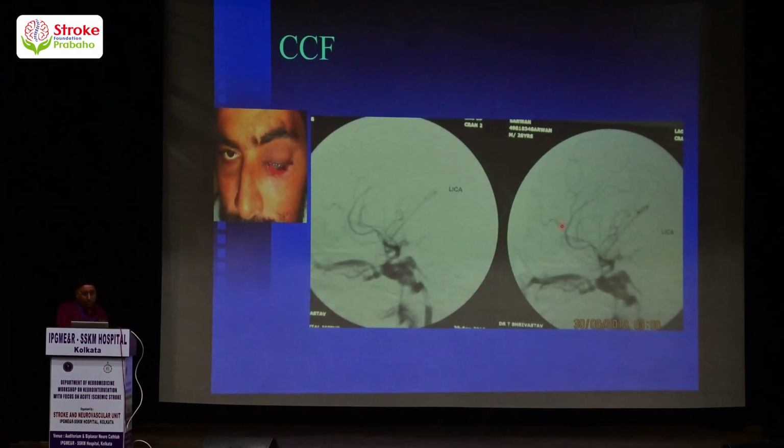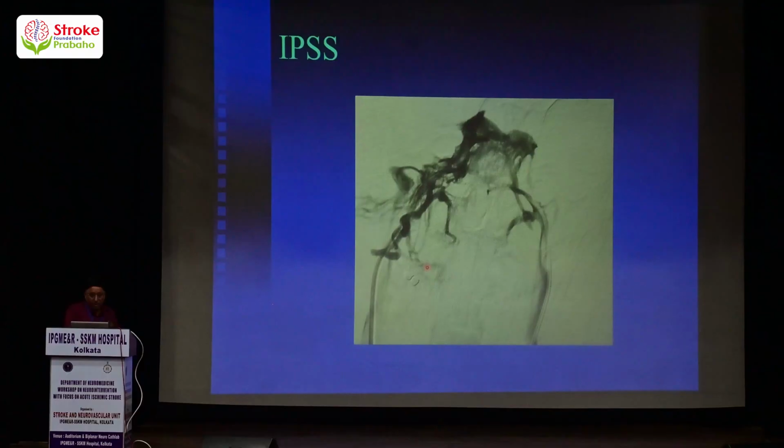Carotid cavernous fistula, again, the gold standard to diagnose as well as treat is the cerebral DSA, and you can see here the prominent superior ophthalmic vein, inferior ophthalmic vein. It is communicating with the cavernous sinus, inferior petrosal sinus here, then posterior.